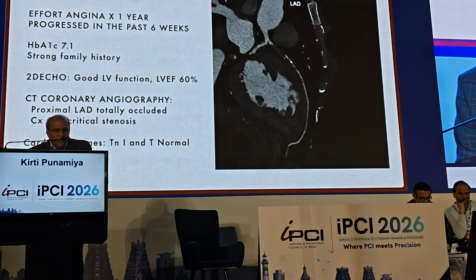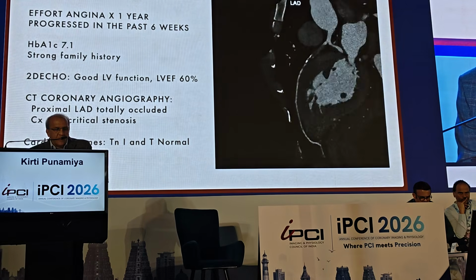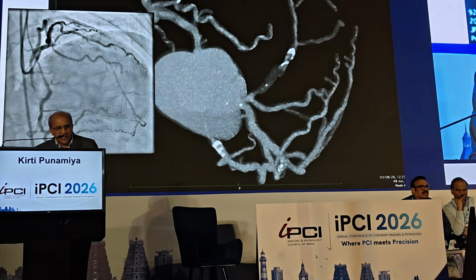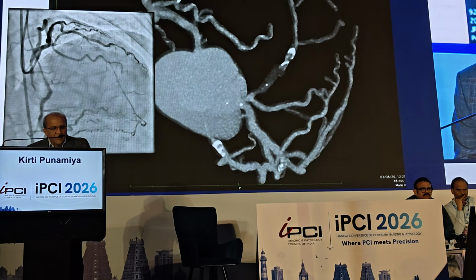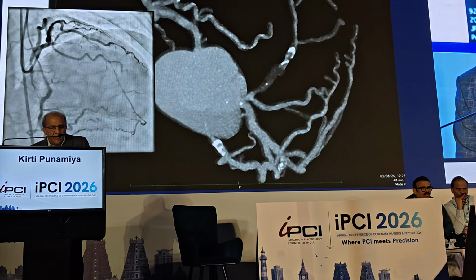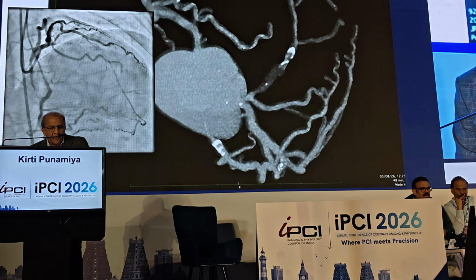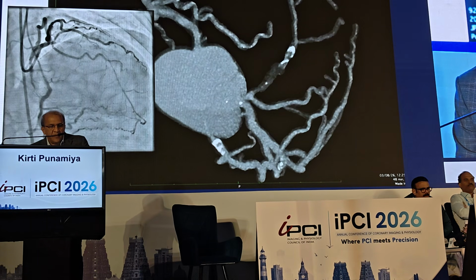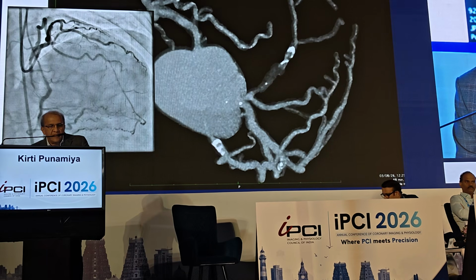And when you look at these seriously, this is the angiography image to the left. It's a long segment CTO with collaterals from the right, and you can see exactly the same definition, that large diagonal branch. You can see a tapered tip. You can see the part where you see nothing, no contrast. Then you see calcium.